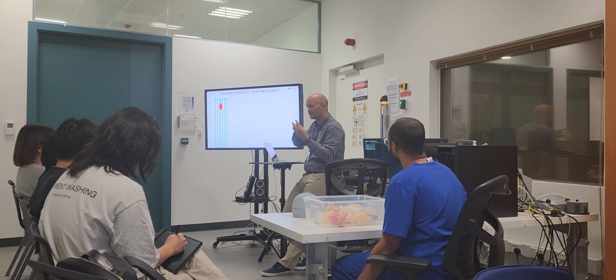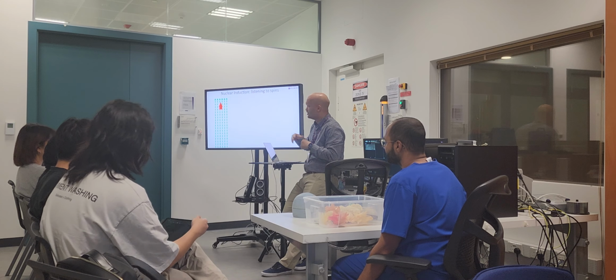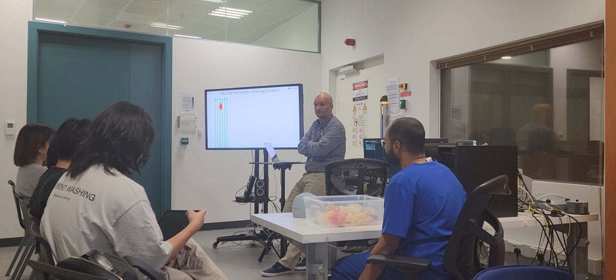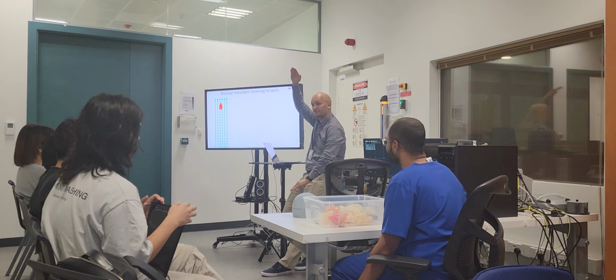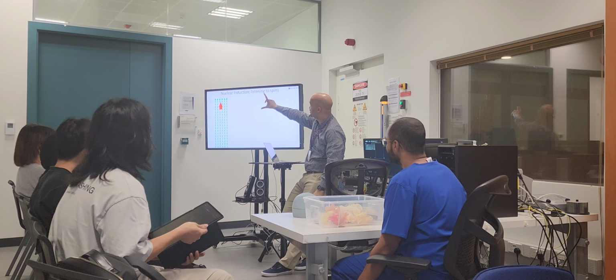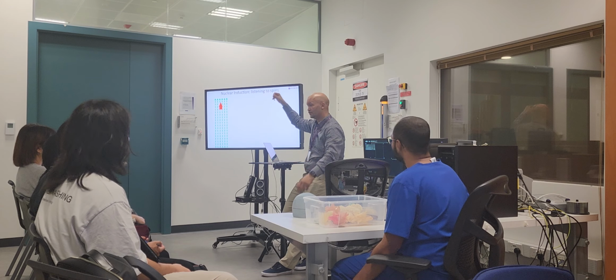the three words, magnetic resonance imaging, right? The magnetic part is we polarize the spins by putting them in a strong magnetic field. The stronger, the better, right? The stronger the field, the bigger that red arrow, the bigger my M0 signal. It's field dependent.